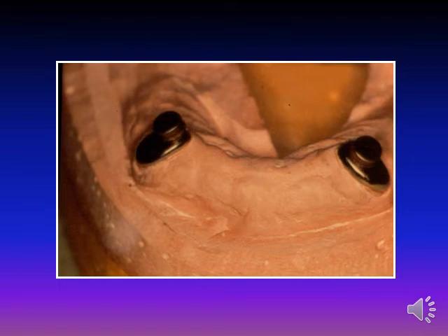Magnet retention is a popular method of attaching removable prostheses to either retained roots or osseointegrated implants. The magnet is usually cylindrical or dome-shaped, attached to the fitting surface of the acrylic resin base of the overdenture, and the magnetic keeper is cast to the metal coping cemented to the root surface or screwed over the implant fixture. This is the magnet keeper.